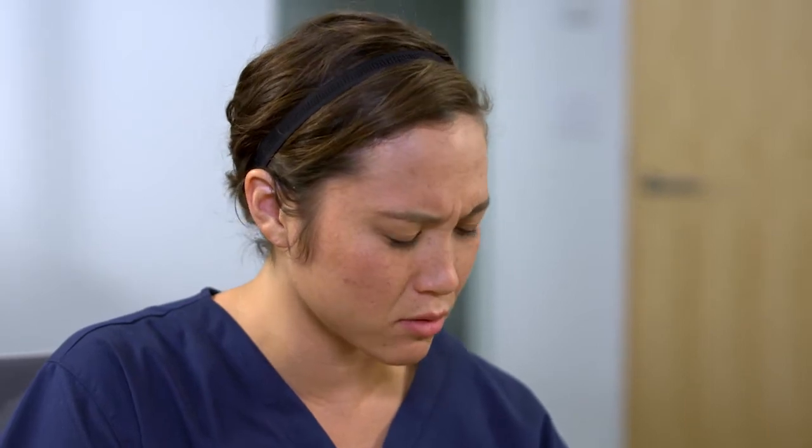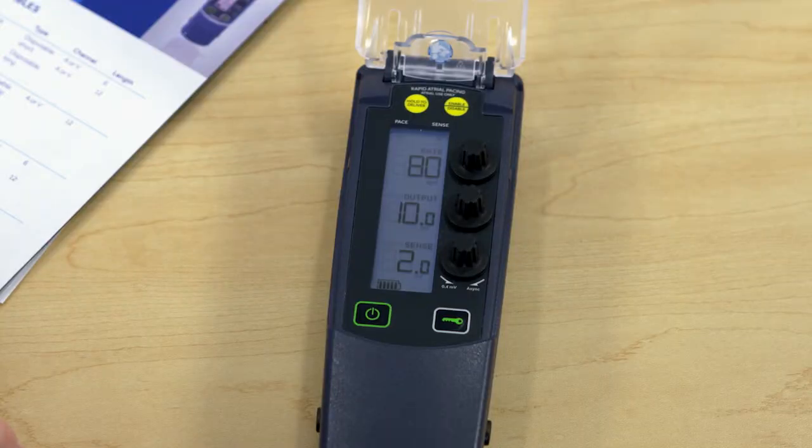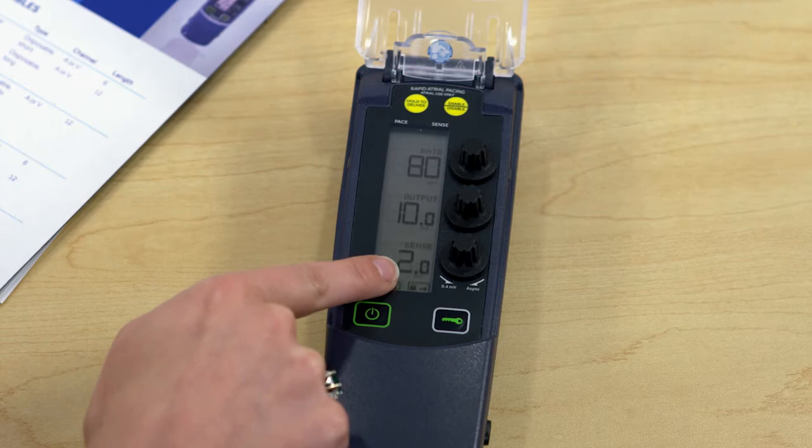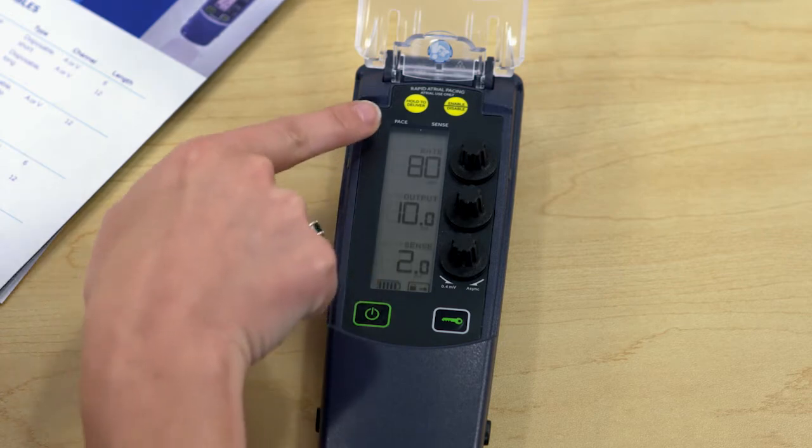Will the 53401 continue to operate if the batteries are removed? Medtronic does not recommend replacing the batteries while the 53401 is turned on or actively pacing the patient. However, if the temporary pacemaker is in use during an emergency situation and the batteries must be replaced, you need to ensure that the device is locked before replacing the batteries. The pacing continues for 30 seconds from the time the battery drawer is opened.